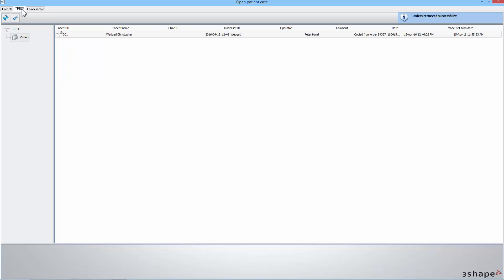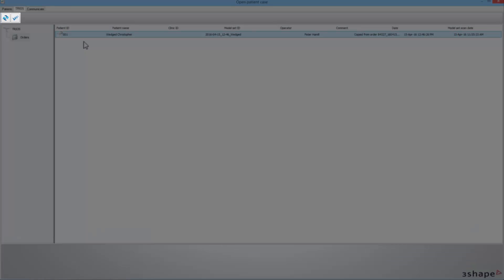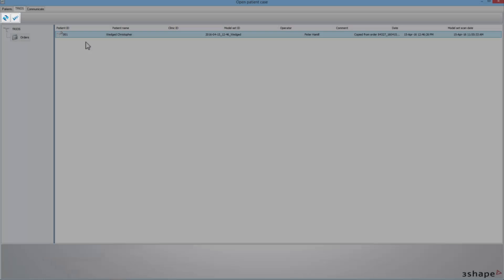There you will find a list of all the orders sent to your lab via TRIOS Direct Connection. Remember that if you cannot see any order in this window, click on the Refresh button in the bar in the upper left corner.